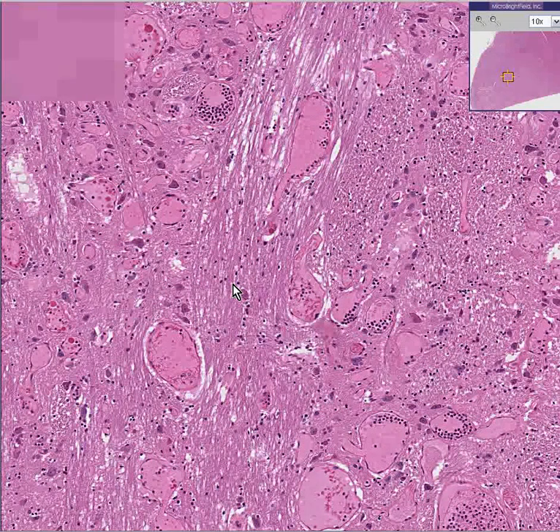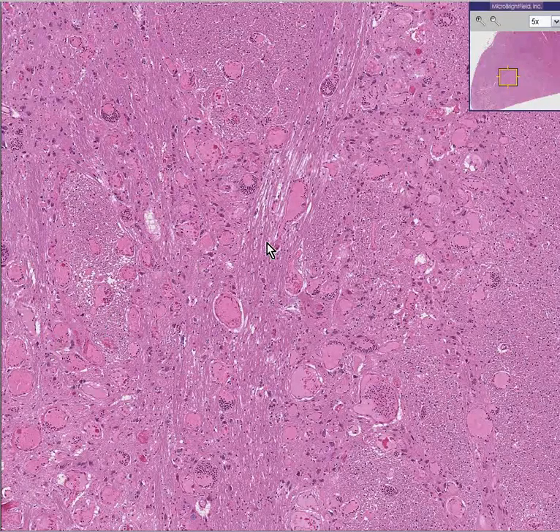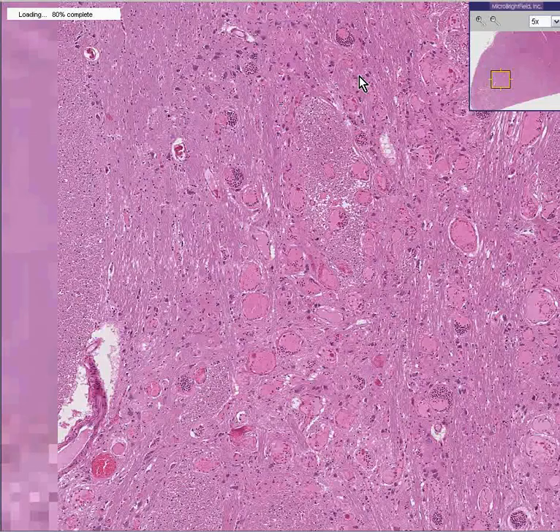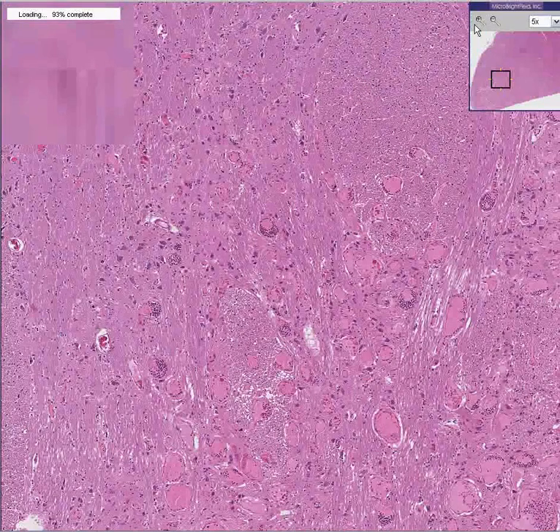If this looks like a bunch of twisted blood vessels to you, some of which may possibly be thrombosed, then you know you're dealing with an AVM. And whereas an AVM could technically be present anywhere where there's blood vessels, which is anywhere in the body, when they are present in a very important part of the body, like the pons, that's where they are feared that they could do the most damage.